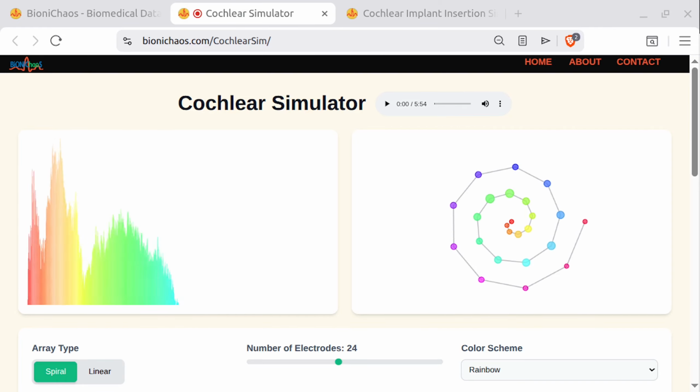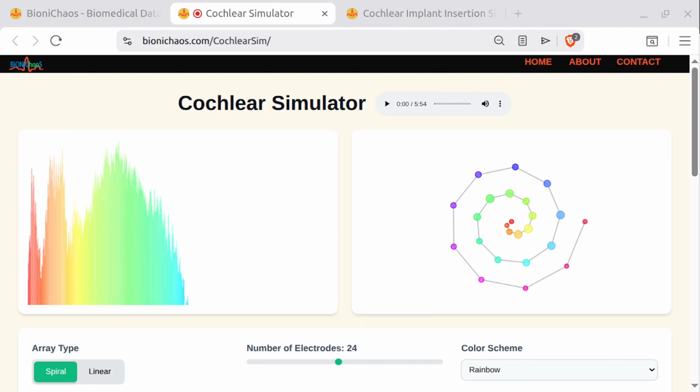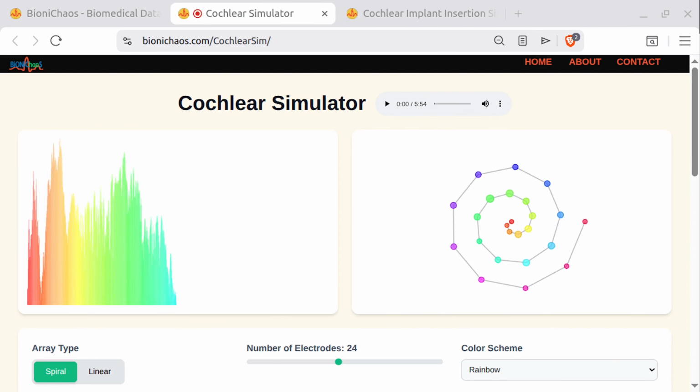And what's even more fascinating is the phenomenon of residual inhibition. Where the tinnitus stays quiet even when the device is off? Exactly. 80% of patients who see improvement find that their tinnitus remains suppressed for hours, even after they take the external processor off to go to sleep. Wow. Yeah, it proves the implant isn't just a physical speaker, you know? It is inducing positive neuroplasticity. It is actively rewiring the central neuronal networks in the brain to calm that phantom noise.